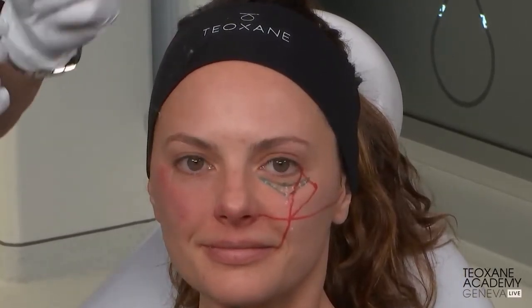You can stop right there. Please give me back some more zoom, just because I want to point out some differences. Zoom in if you can. Just a full face. Oh, perfect. Right there. If you look at her face, you can tell how many differences are noticeable there. So she has a shortened eyelid cheek distance right there. The cheek seems lifted, and she has not been treated in the nasolabial fold.